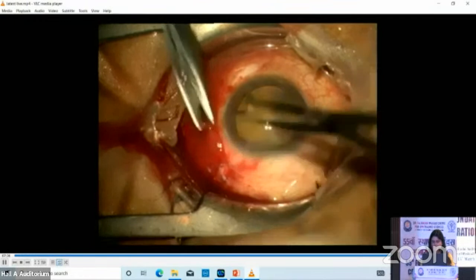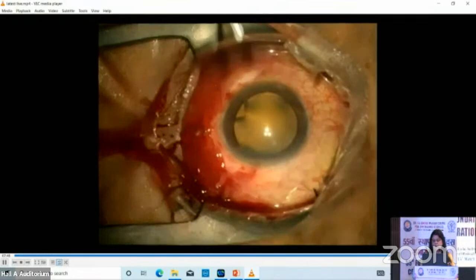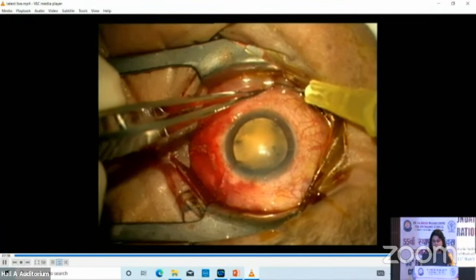As I mentioned to you, in this particular case, the patient had to stay in the isolation room for 36 hours. That is why we had to keep the plaque in situ for 36 hours. The target dose was supposed to be around 80 grays.